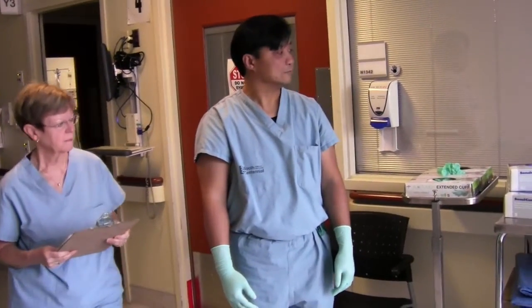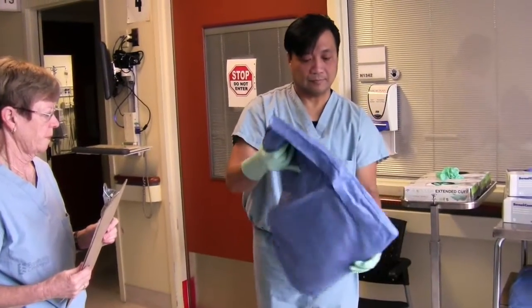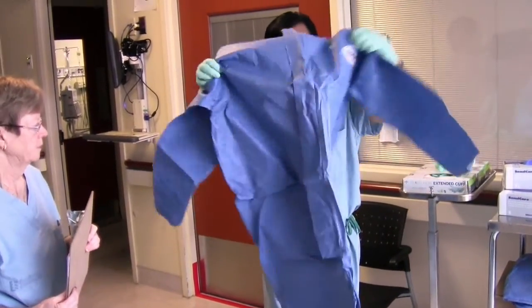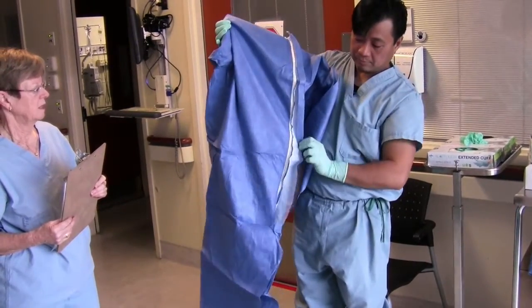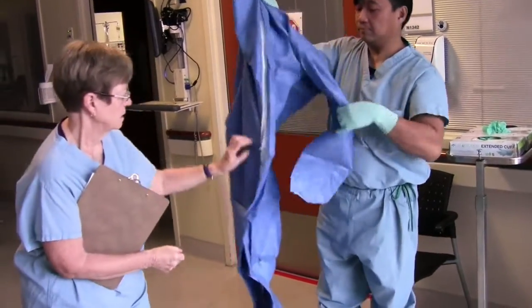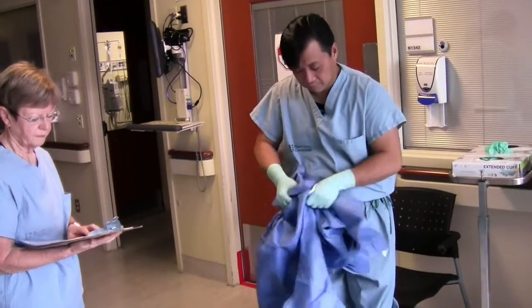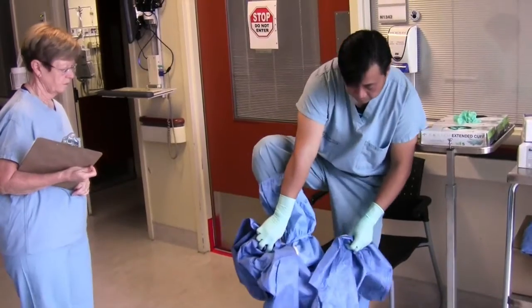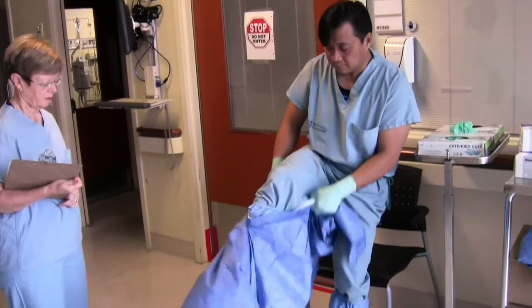Step 4. Put on coverall. The coverall has a zipper on the front. It also has an adhesive cover which will need to be pulled off later to stick the flap to the front of the coveralls. Coveralls are done like a pair of pants with a zipper at the front. Even though you are donning in a clean area, try to ensure you have as little contact with the floor as possible in order to avoid contamination with other microorganisms.